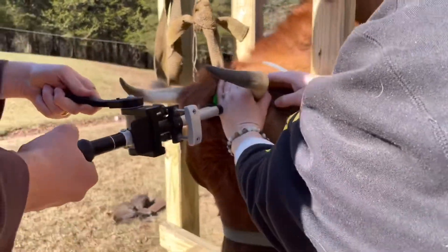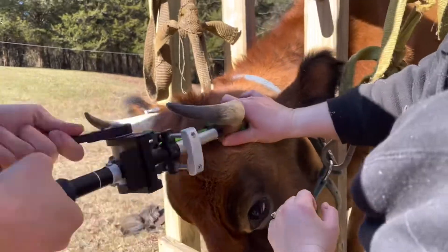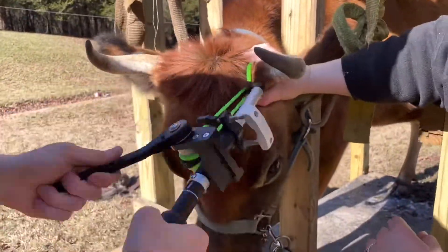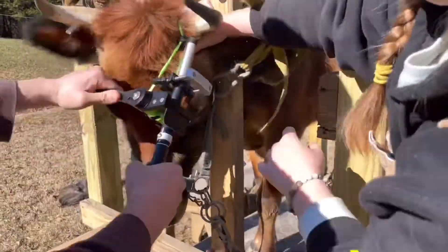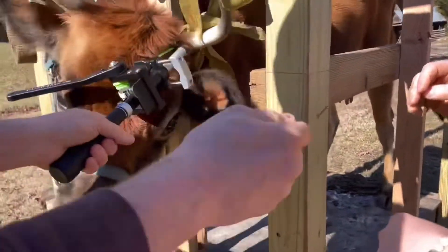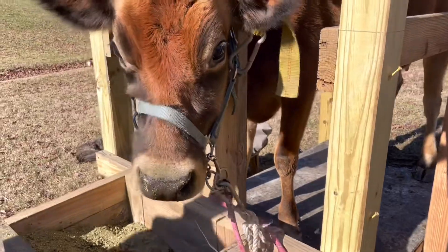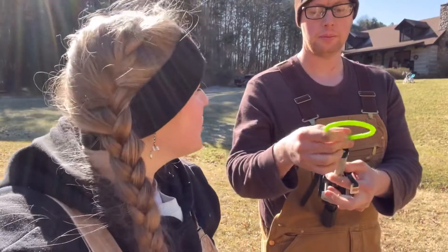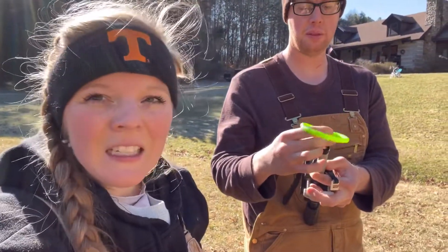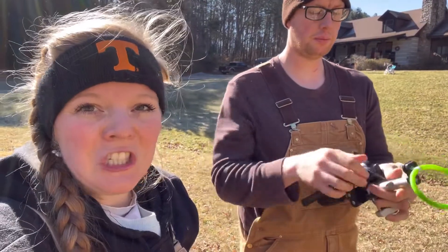I can hold it down right here — I can't have my hand right there though. That's where it's got to go. Now it's fully tight. How do you know it's fully tight? Because I can see. That was nerve-wracking. Samuel said he got it as tight as it could go, and then he just snapped it shut.